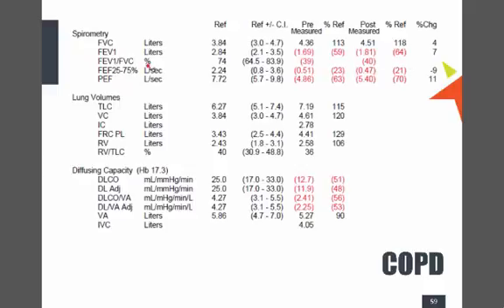So here we go again. Okay, so we're into, is there any obstruction? Well, that 39 is definitely not in normal range, nor the 40. And remember with COPD, you make the diagnosis, is it mild, moderate or severe, after giving ventolin. So we've definitely got obstruction. What is my FVC, my volume like? So it's 4.5, it's within normal. That's 118%, so that would tell you it's pretty normal, anything above 80.